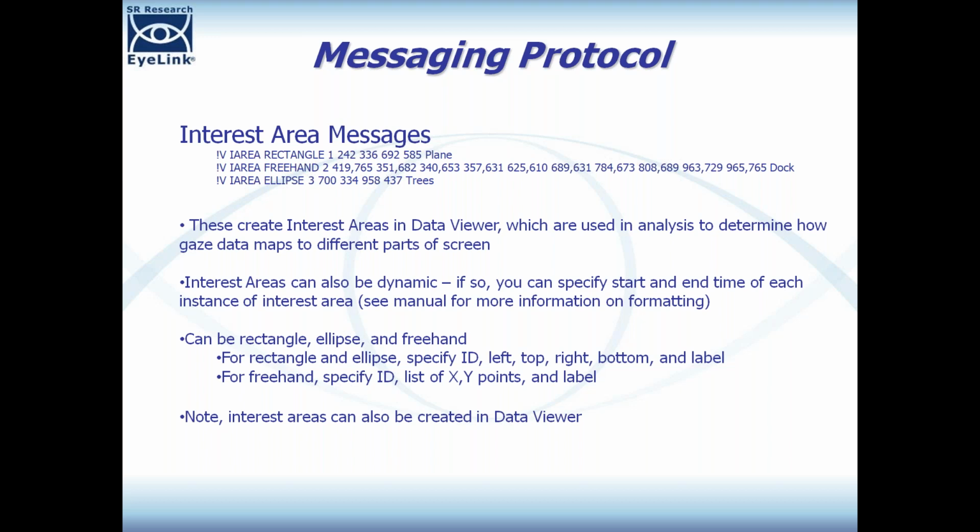You don't have to do this. Let me point out down here, you don't have to create the interest areas through the messaging protocol. You can also draw them by hand in Data Viewer. And I think sometimes it's better to send them through messages to the EDF file, and sometimes it's better to draw them in Data Viewer. As a couple examples, let's imagine you were doing a visual search experiment where you have like 100 T's on the screen and 1 L, and in your experimental programming language you have already figured out where you're going to position all these T's and the 1 L.